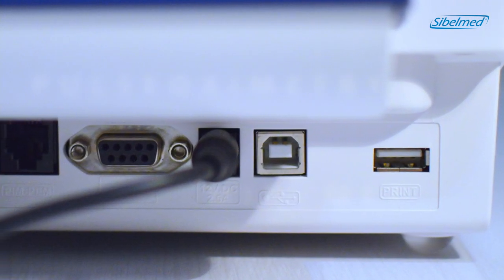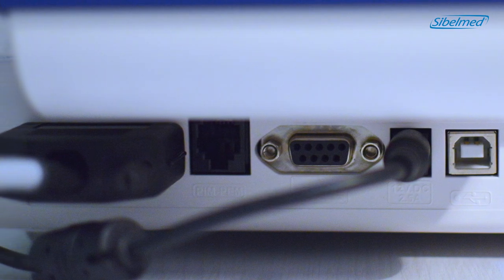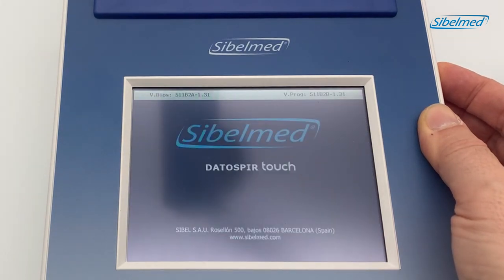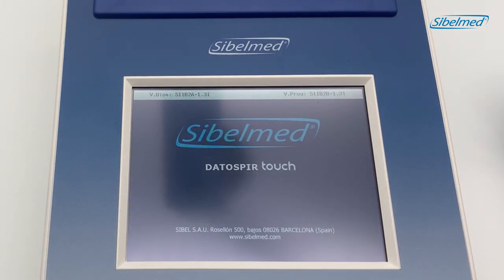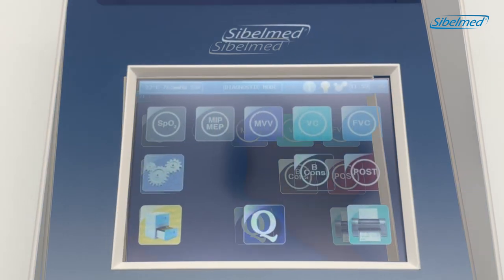The other inputs are used to connect optional modules such as pulse oximetry or maximum pressures. We will see the icons to help us in the connection. When everything is connected, turn on the spirometer by pressing for one second the on/off button located on the right side. After the logo, we will be able to see all the main menu icons.